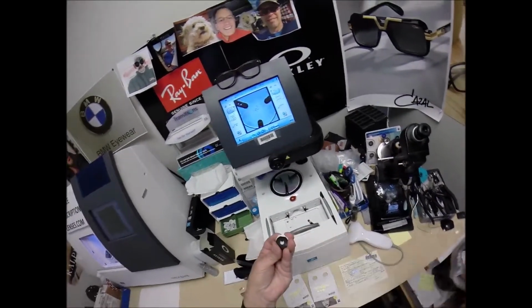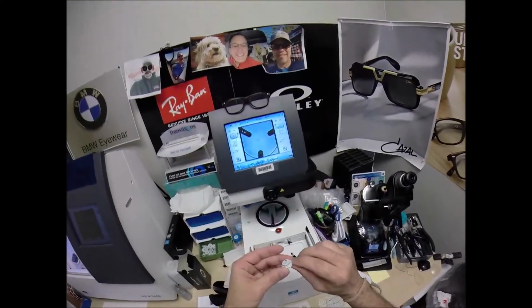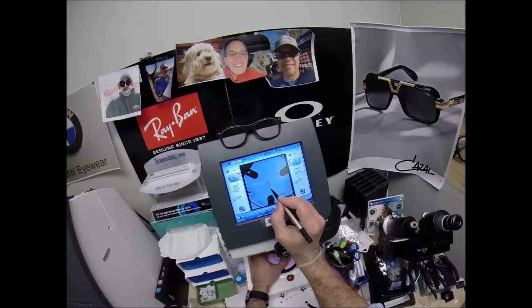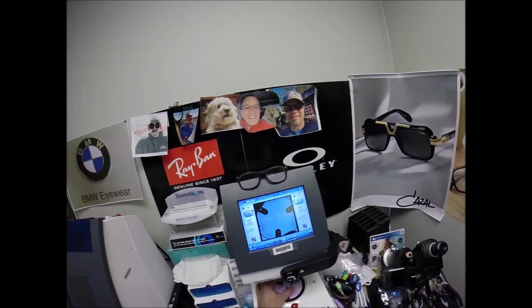Pull the paper away to make the black side sticky. That silver button on the back is a magnet. It's going to do its job twice. The first time it's going to attach itself to another magnet there in the arm. Get everything laid out perfectly. That blue cross is the geometric center of your frame. Your eye is just above that and inset.